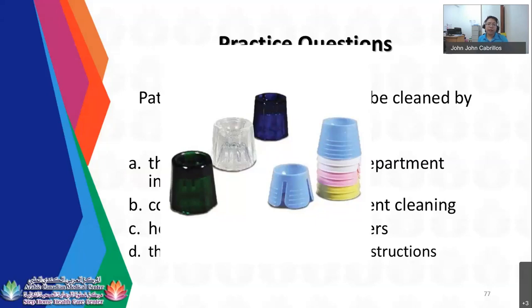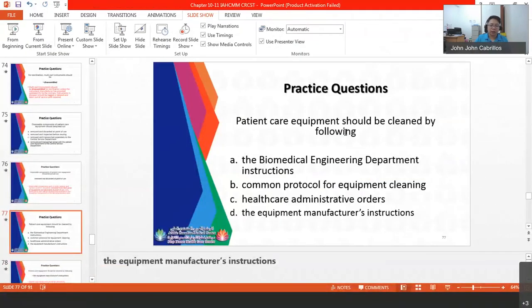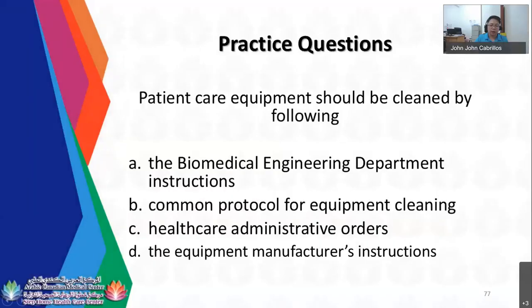So it depends, but the majority of the disposable should be disposed unless instructed by your physician. And not because they are instructing you to sterilize it, you will follow them. You need to check your instrument if it is still working the same as when new. If not, you can tell them that you cannot sterilize it because it is not working the same as when you first used it. So any question?